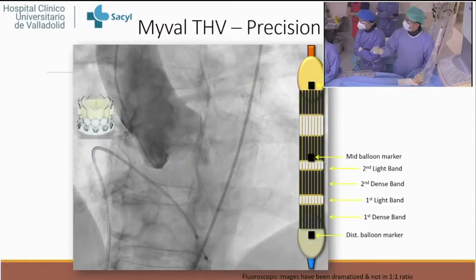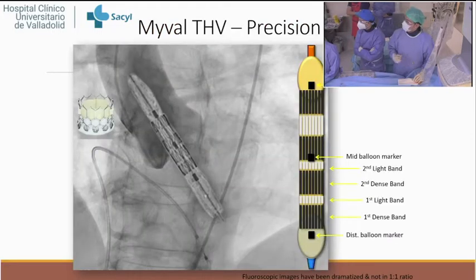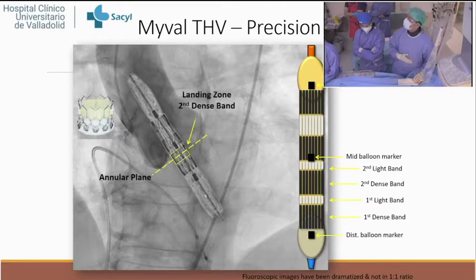The position is very simple because there are some radiopaque bands. The second radiopaque band is the one that we place in the annulus, because there is some ventricular foreshortening. So we start in this position, which is 70% aortic, and we end up with a position normally 85% aortic and 15% ventricular. Next slide.